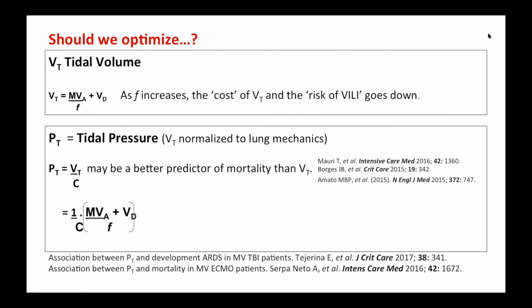There have been some studies, shown at the bottom, which associate the tidal pressure and the development of ARDS in mechanically ventilated traumatic brain injury patients, and also an association between tidal pressure and mortality in mechanically ventilated ECMO patients. So perhaps that is something to consider in the way that we are moving forward in terms of applying the technology that we have.